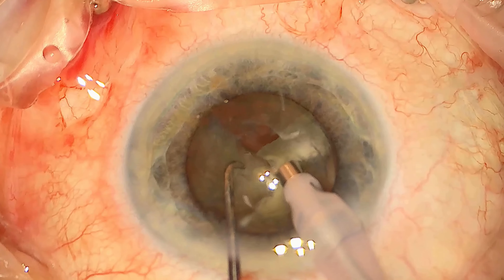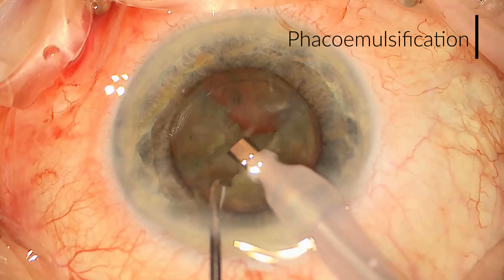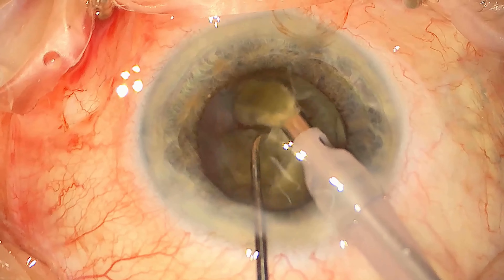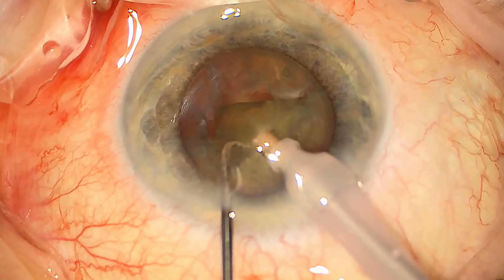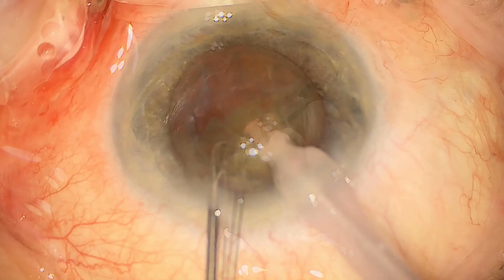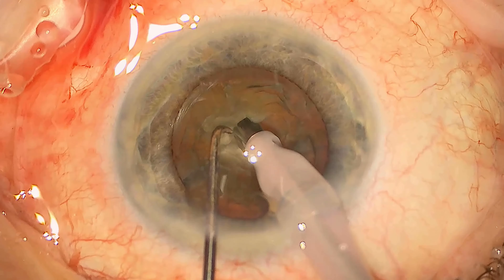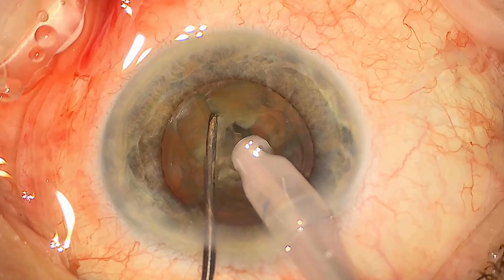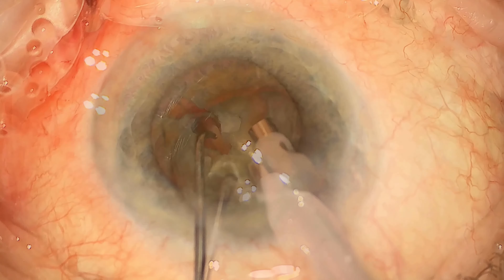Once the lens is in smaller pieces you're able to phacoemulsify the lens — essentially break it down and aspirate it out — and we repeat this process in each quadrant. We're able to rotate the lens around and break it down into even smaller pieces until all the cataract is away, keeping in mind that we're trying to respect the bag or the capsule the whole time because we need this when we're inserting the lens later on.